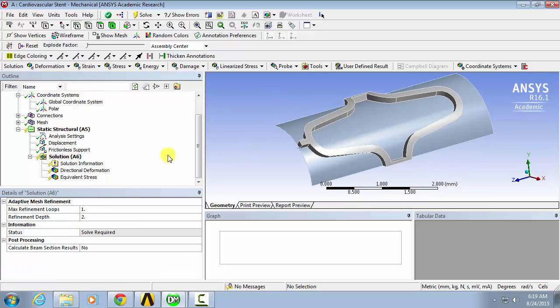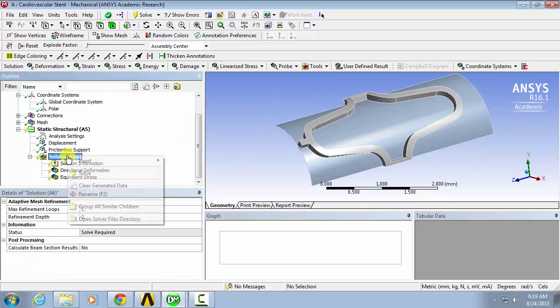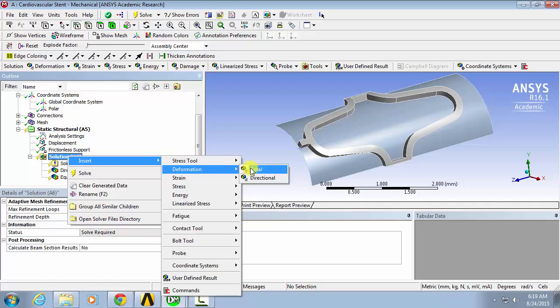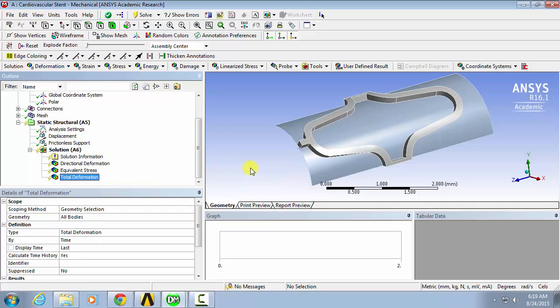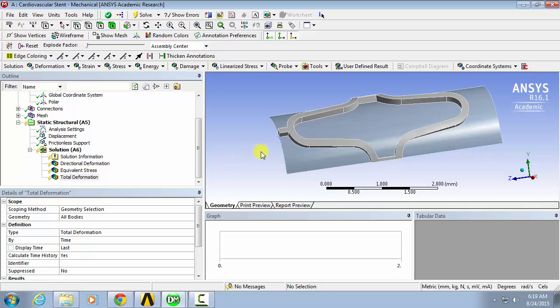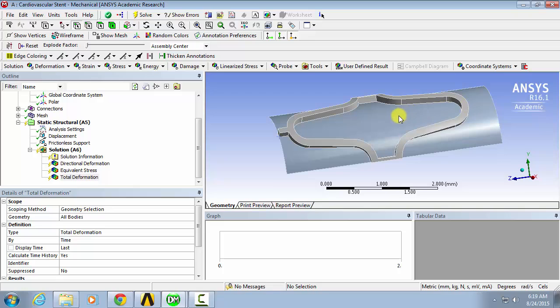Then, I'll also add another deformation total for all bodies. That way, we can see what happens as the stent interacts with the balloon as it expands and the stent starts to contract inward.